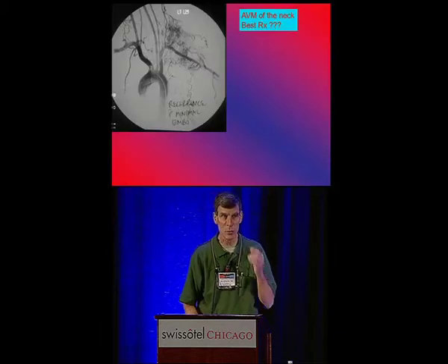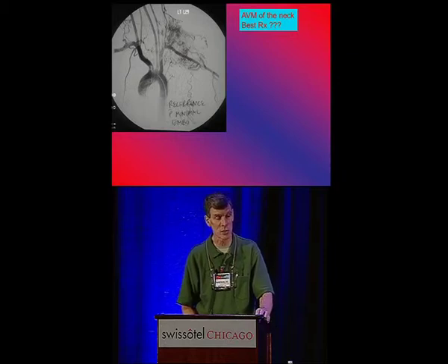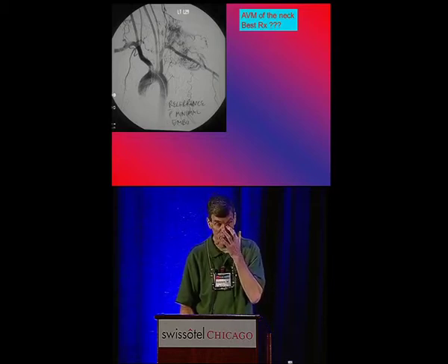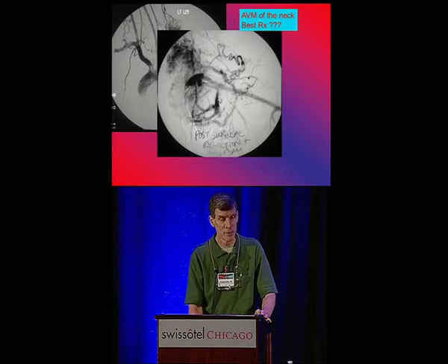For instance, in this one, we did 2 or 3 transarterial embolizations to get the flow slowed down, get some of the veins under control, and then had the surgeon go in and do a wide debridement because there was just almost no way to get this completely controlled with either direct stick, because there's a million places you'd have to stick, or transvenous work, because you would have had to totally occlude every vein in the left brachiocephalic area.